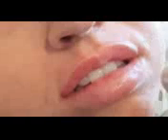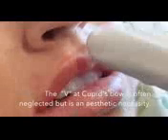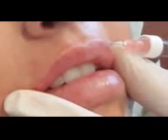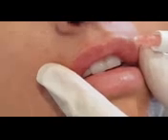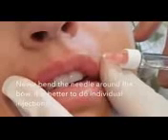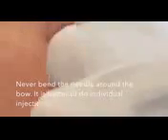You see it? So you want to go to this point here, and then another one down. We'll do that now. So feel the product there. If I raise the needle up, you can see where it's right at the peak. Nice, perfect.